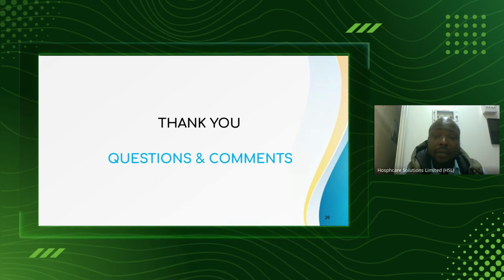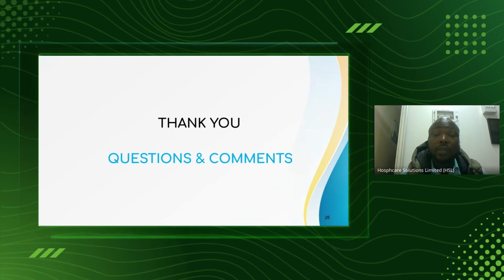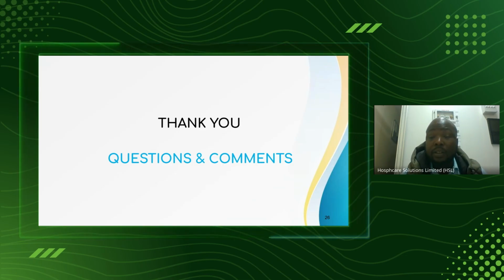Remember, even at the compressor point, we have a pressure gauge. So if the compressor continues running, you should be able to know that it's a problem, because at some point you have cut-in and cut-off pressures. Once the 8 bars has been achieved, the compressor will switch off automatically. So once you realize the compressor keeps on running without any procedures going on, that should tell you there's a leaking point somewhere. That's one.